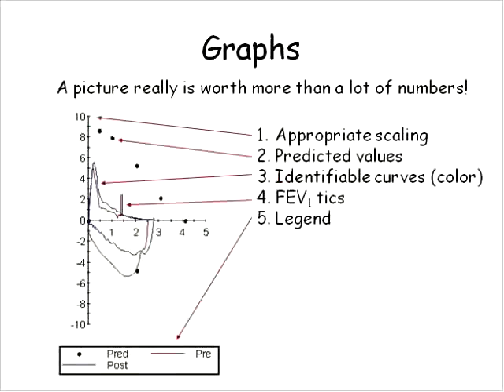I'm sure you've all seen graphic displays of flow volume curves where the flow volume loop itself is so small that it's almost impossible to tell that it's a flow volume loop. Unfortunately, that's an all too common occurrence. That's particularly problematic if you're testing pediatric patients. I hear pediatric lab personnel all the time complain that the software we use was designed for adults, and when graphs are displayed for our 5-year-old patients, we can't really make sense of them because the scaling isn't appropriate.